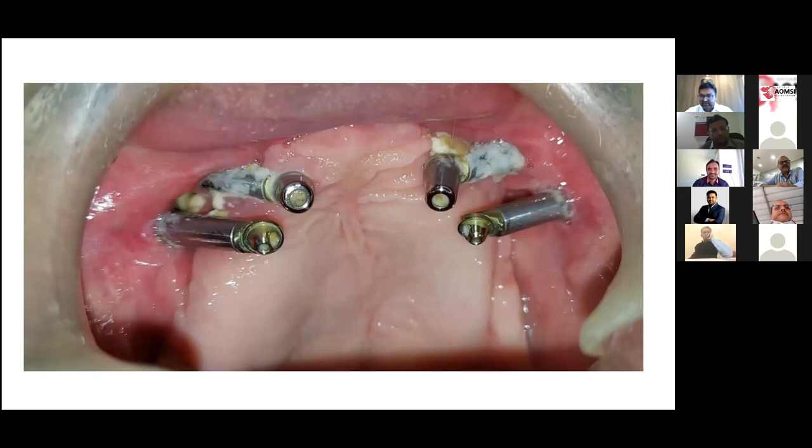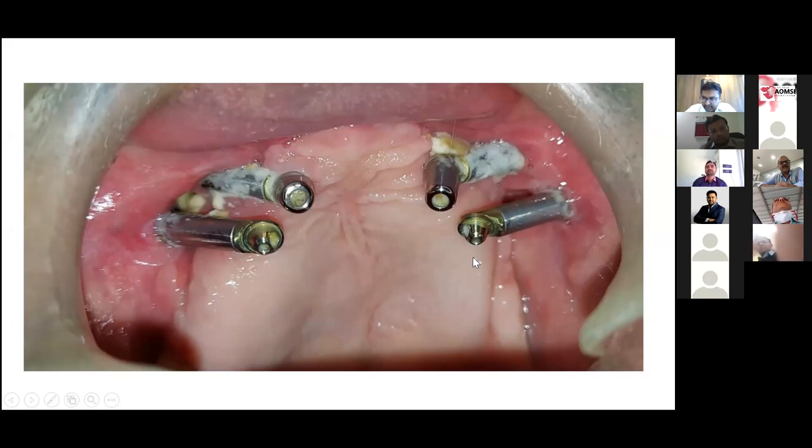Now, my question to Nihal sir. Nihal sir, can you unmute, please? Sir, can you see these hanging shafts here? Yes. In this pre-op planning, we superimposed the pre-op mucor CBCT on the post-maxillectomy defect so that we can approximately get the good length of the zygoma implant, which has a nice outcome at the palatal side, like when the patient has an intact maxilla. But now after the healing, we have a long hanging shaft here. Can you give us any idea of what we should be doing so that the patient does not have post-op food lodgement there?